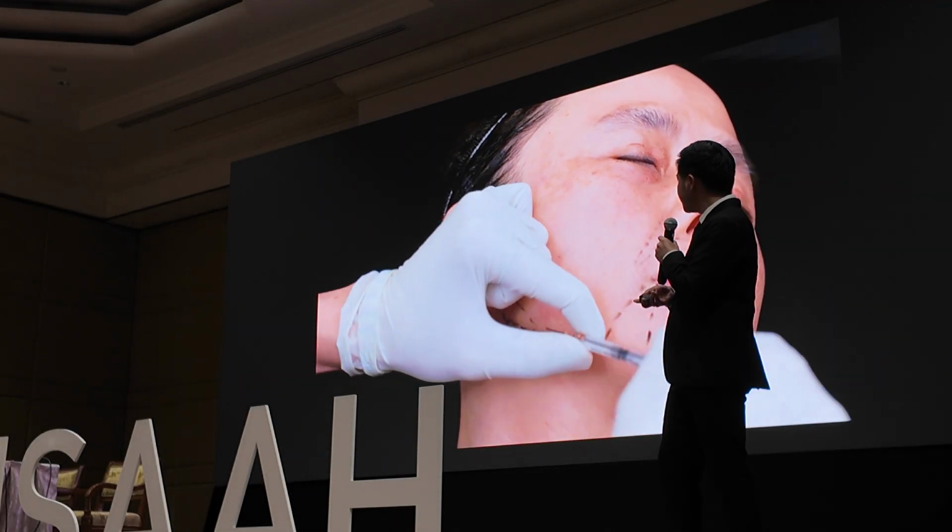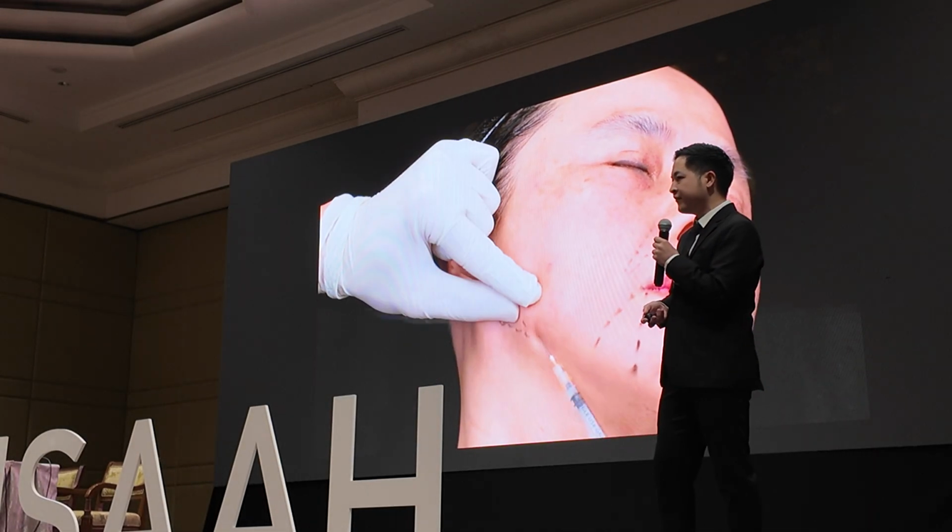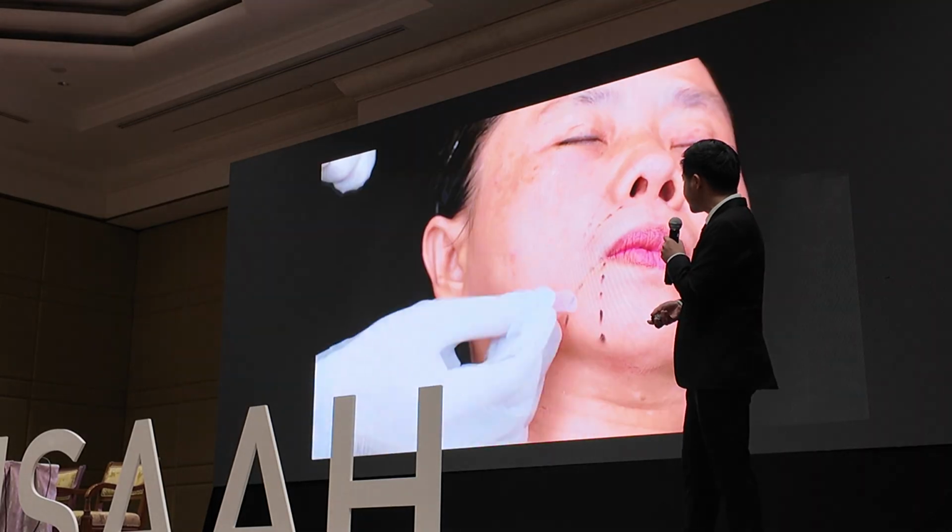For example, if you do this, if you go too deep, it can cause injection into the facial artery. So please be aware.